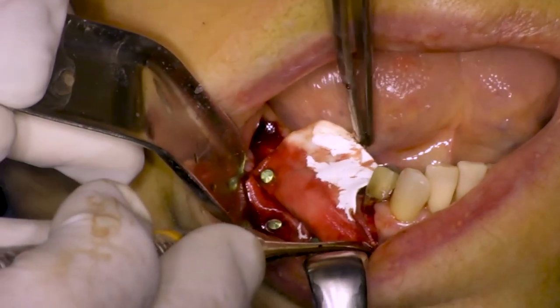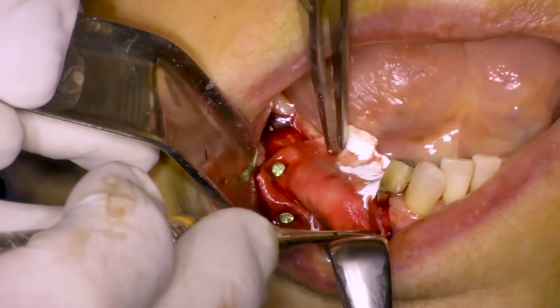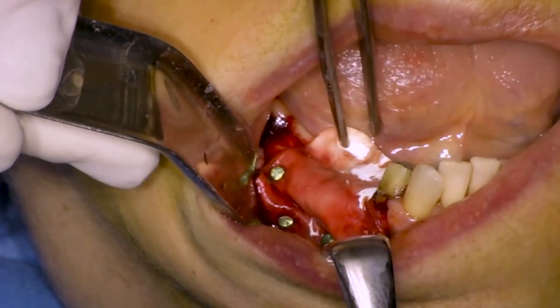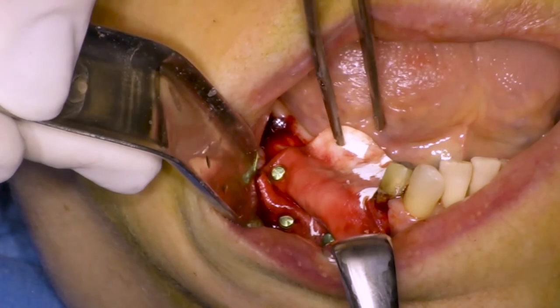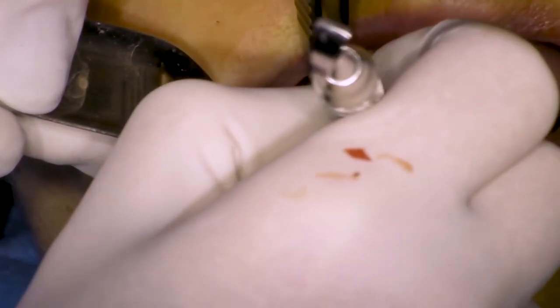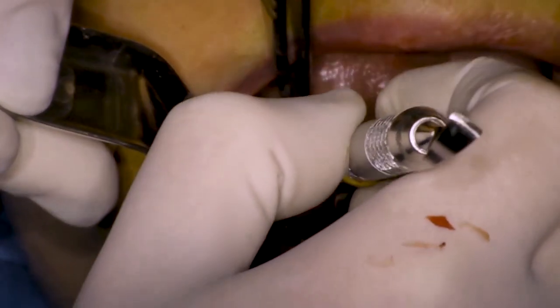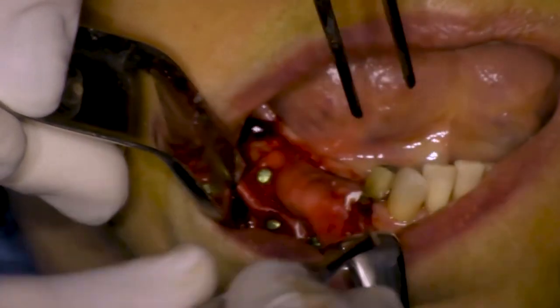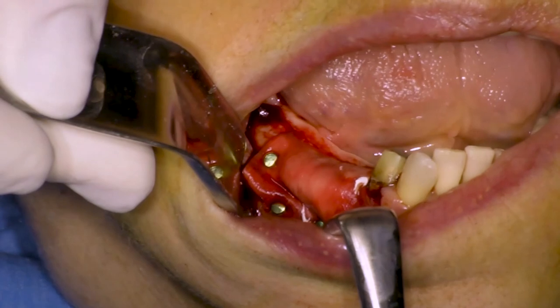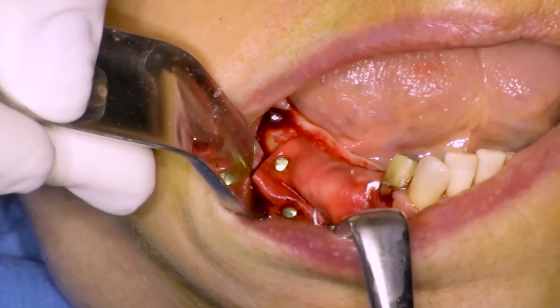It is absolutely important that the membrane has been properly positioned and fixed at the mandible, otherwise I wouldn't be able to do that. Now I pull the membrane both mesially and lingually to understand where to fix and stabilize my membrane mesially and lingually.